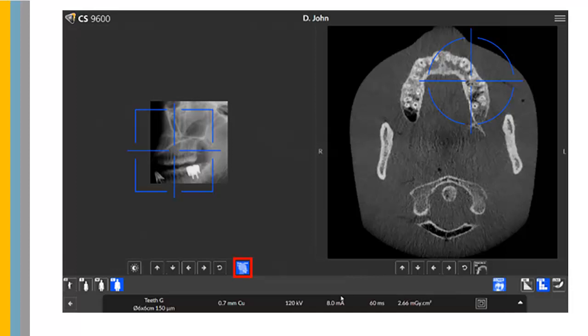To use Smart Auto 3D, you must first acquire a Scout View 2D image. Next, deselect Scout View 2D. Then the Smart Auto 3D function becomes available.